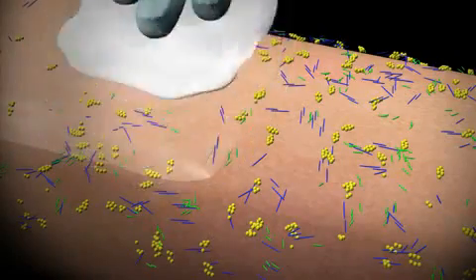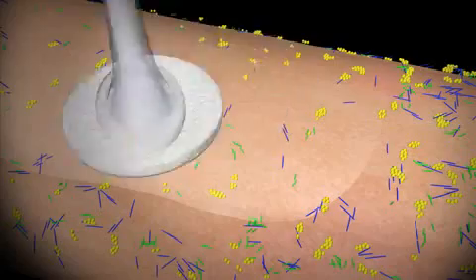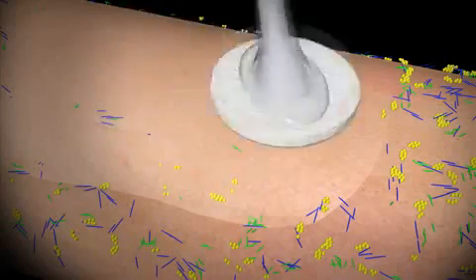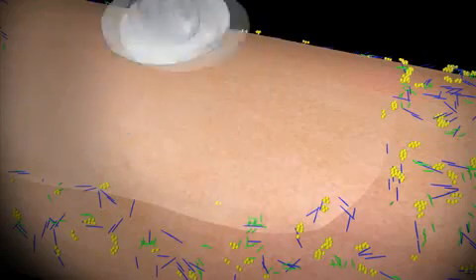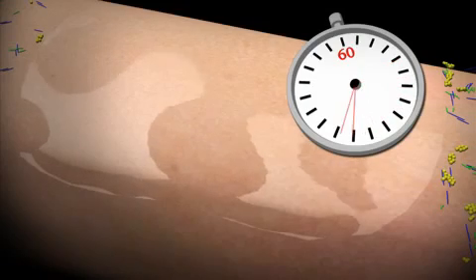A 1 to 2 minute clean scrub with a chlorhexidine preoperative skin scrub 2% CHG cloth such as Sage or Hibiclens is recommended. Following the preoperative skin cleansing, a surgical site prep is best accomplished by the application of 2% chlorhexidine gluconate, 70% isopropyl alcohol such as ChloraPrep. Prep the skin using a vigorous back and forth scrubbing motion, then work outward to the peripheral area. It is important to allow the area to completely dry for a minimum of 30 to 60 seconds.